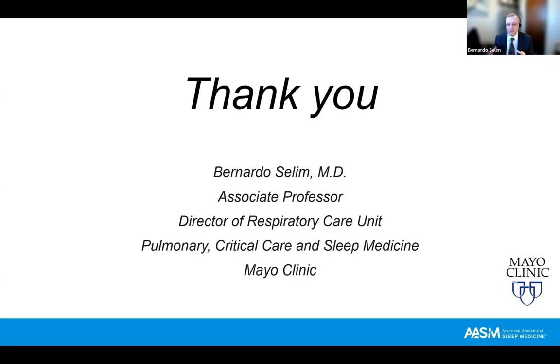When you go to the real ventilators, they do have their waveform, and you may, by the waveform, see that the exhalation does not reach zero, and you may assume that there is auto-PEEP. But these are not like the big ICU ventilators where you can calculate the auto-PEEP in these patients. And remember that you can still have auto-PEEP and the flow in exhalation can reach zero, because the areas in which the compression or closure of the airways are going to be completely collapsed. Therefore, there's no flow. So the flow will return to zero, but it doesn't mean that you don't have auto-PEEP. So no, none of the non-invasive ventilation machines can calculate that. You have to go for the invasive ones.